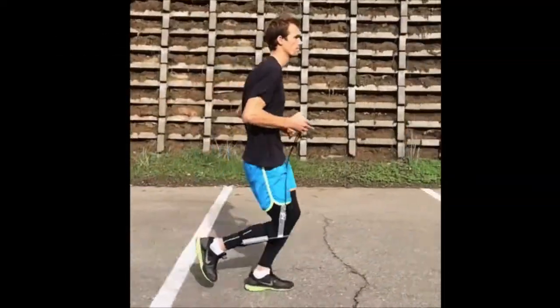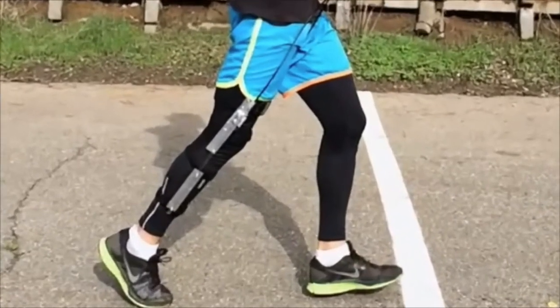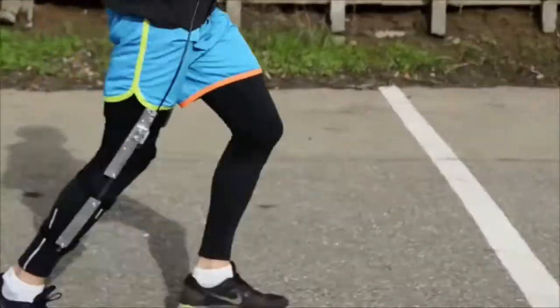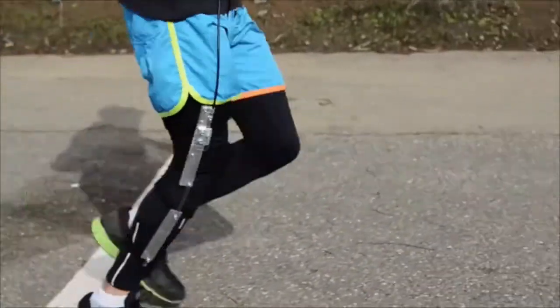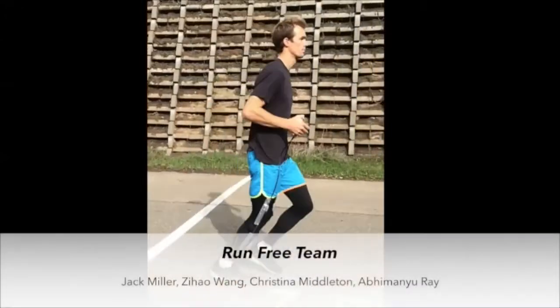During the stance phase of Jack's gait, a spring element supports a portion of his body weight, capturing the impact energy through the knee flex and assisting him during push-off by releasing the stored energy. Then the spring element is disengaged, allowing for an uninhibited swing-through. Run Free Knee Brace — experience the freedom of technology.